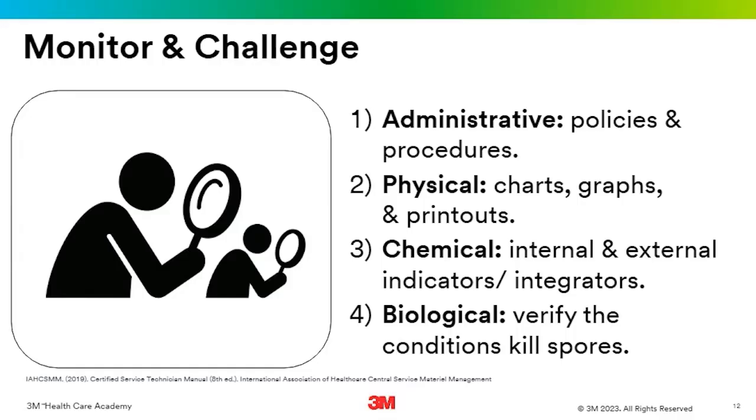Now, when we think of monitoring sterilization, everybody jumps to a BI, right? Or a process challenge device. As I learned from my poll today, apparently everybody loves biological indicators on my LinkedIn. And they were very upset I didn't make it an option for people to pick. But there's 3 other groups that we utilize to monitor and challenge sterility.